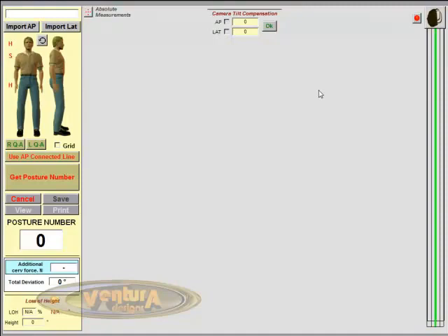With Posture Pro, you really can use any type of digital camera, but taking the picture can be important. We prefer that you turn the camera sideways, turn it 90 degrees, so that it's up and down, taking what's known as a portrait mode picture, where the viewing screen is taller than it is wide. That's the same format as the human body, taller than it is wide. So you'll turn the camera sideways, and Posture Pro has a feature in it that will automatically rotate the picture so that the person's standing up and down, and it fills in most of the image on the screen.